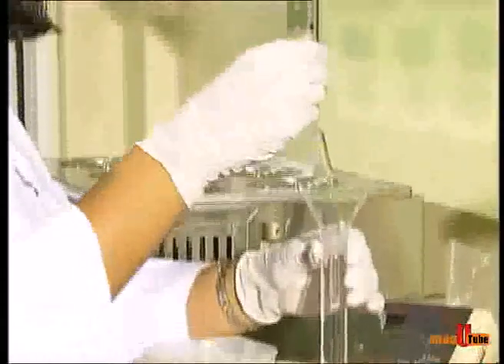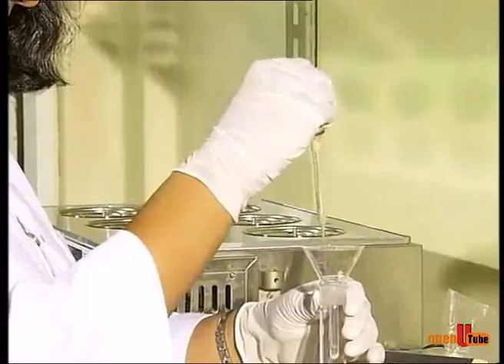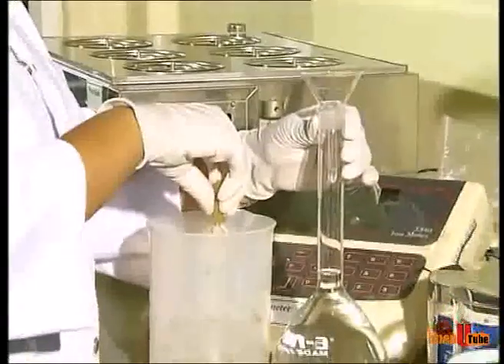It is very important to top up the final volume with the help of a dropper.